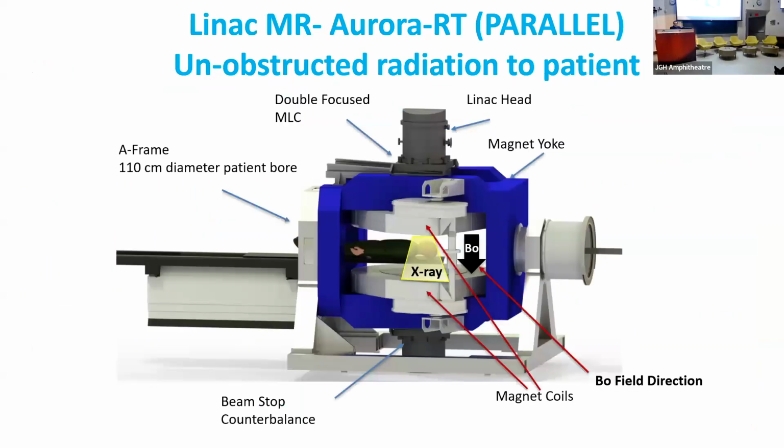So this is how it looks. We do not use cylindrical MRIs. All the MRIs you see in the world are called cylindrical. You cannot use those. You've got to use an open magnet, an open MRI, or what we sometimes call biplanar, two planes or two poles. So where are the two poles? One here and one there. Okay, and it's parallel, which is the preferred version, because the magnetic field in these things, see this black arrow, is parallel to the radiation configuration, obviously.